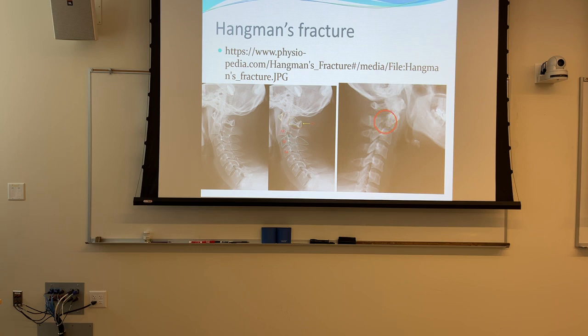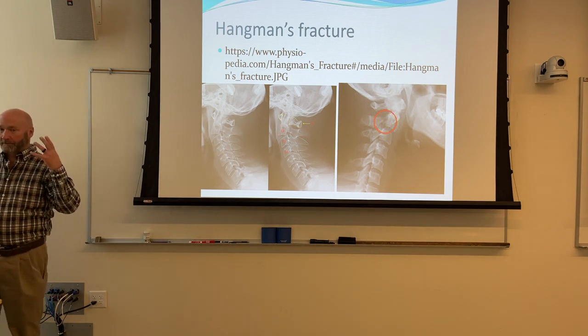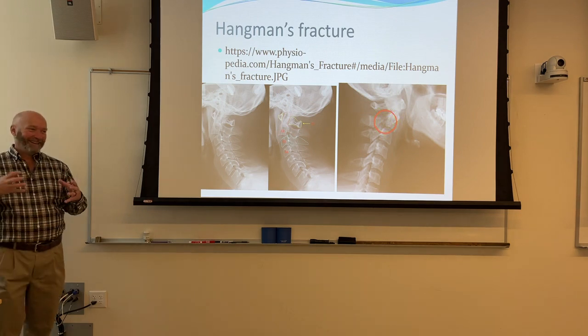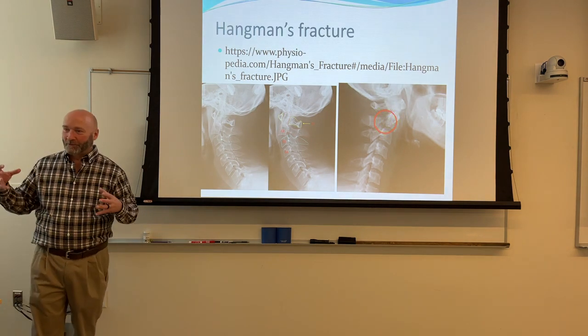That's got to be miserable. If you've not, it's kind of the same situation. They'll put something on the patient's head, sometimes with pins in it, sometimes just with weight on it, and they'll hang weights off of the head of the bed just to try to pull traction on the patient's head.